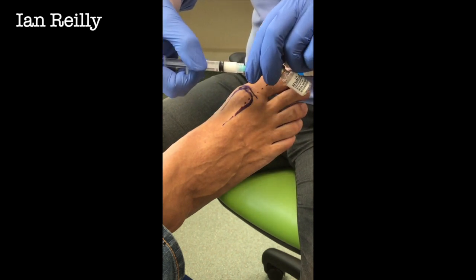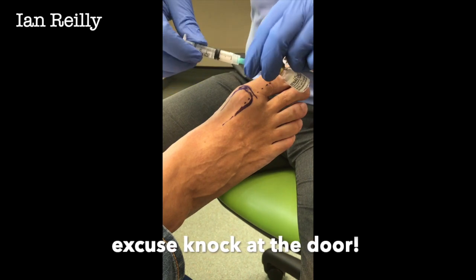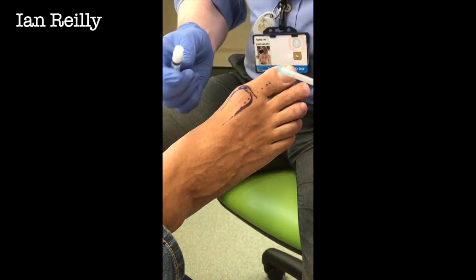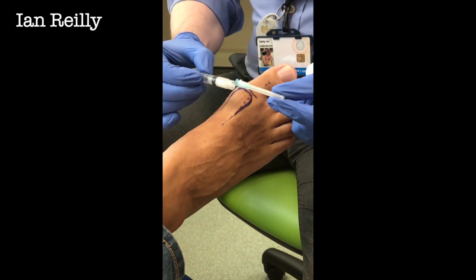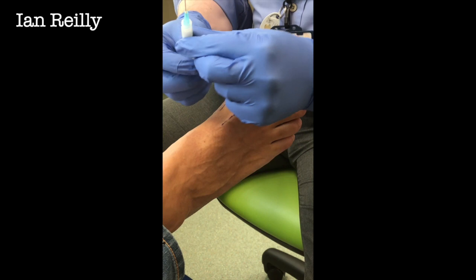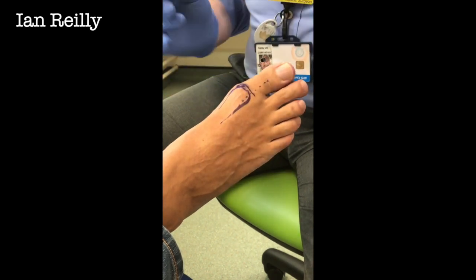And what always happens when we set the video up is somebody comes in. Welcome Akram, come in. 21 gauge to draw up with, 23 gauge needle to inject with. We like to use that on our NHS patients. We use a smaller one on our private patients.